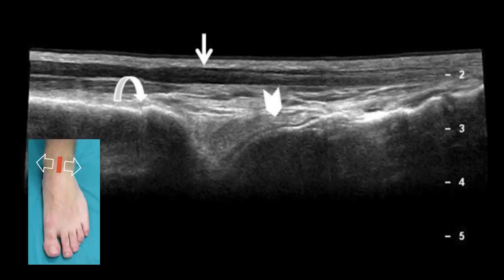Now, if you take your probe and switch it from axial to now longitudinal, you can see that this view shows the anterior tibial tendon running over the tibial-talar joint. Now, the curved arrow indicates the distal tibial epiphysis, and the arrowhead indicates the talar dome.